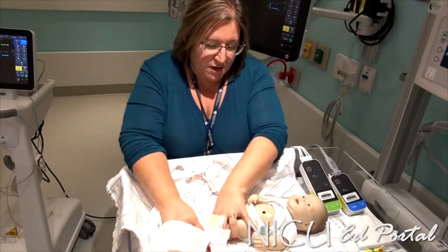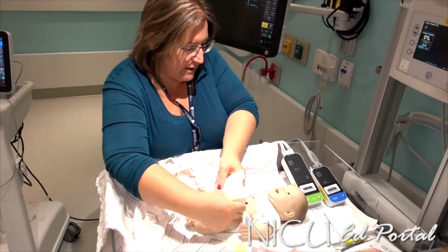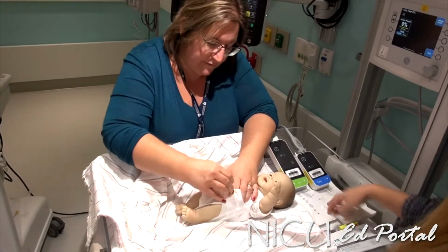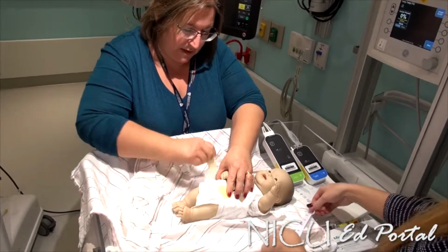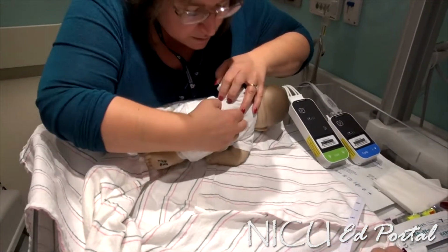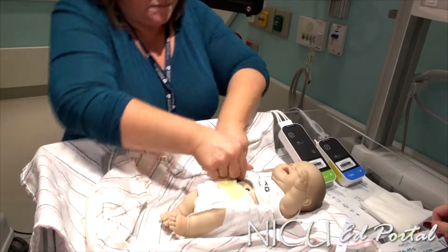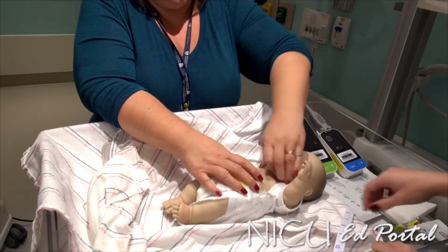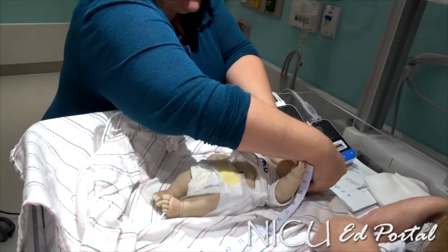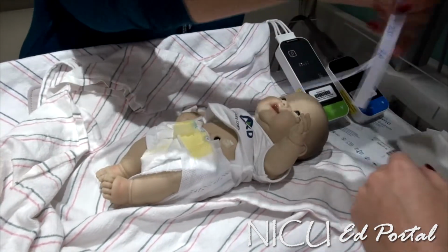How much does Patrick weigh? Patrick is 2.6 kilos right now. And I did not do his head circumference yet. I'm sure it's under the 38 centimeters, but I will do it. I have a measuring tape right here. Just a second. So he's got a clean diaper on now. No leads on his back. I should have taken this off first. His head circumference is 33, so that's perfect.